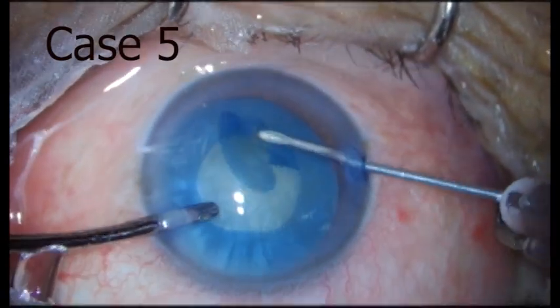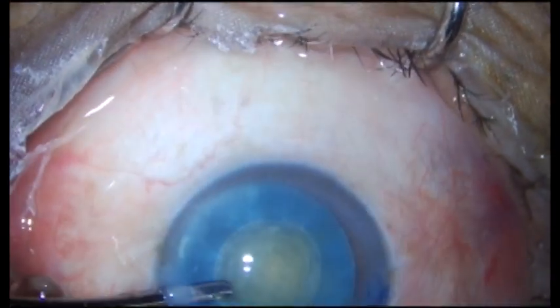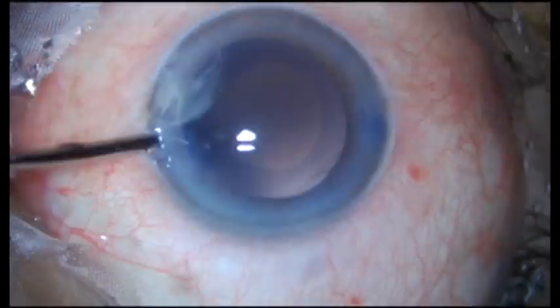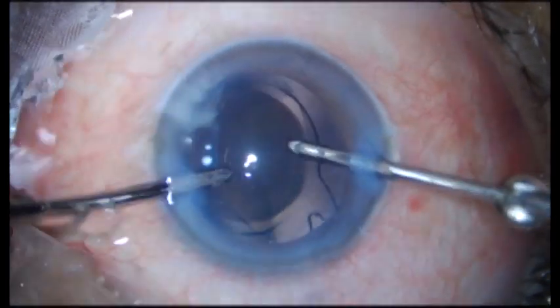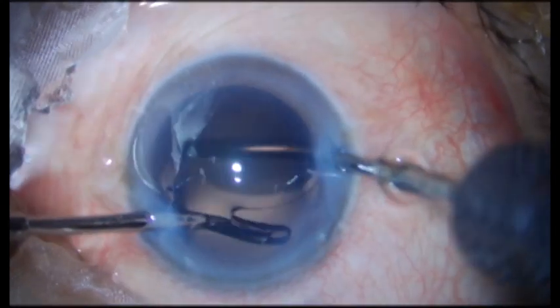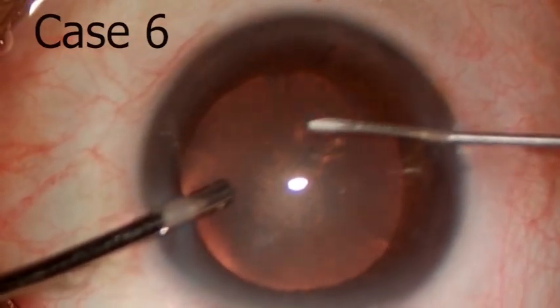We did a pilot study on 56 eyes as a case control study, where 28 cases each of phacoemulsification with visco and without viscoelastic were compared with their endothelial count preoperatively and postoperatively, and we found that there is no statistically significant difference in endothelial damage in the non-visco group. There are other supporting studies which also show that surgeries done under irrigation do not show any significant endothelial damage.